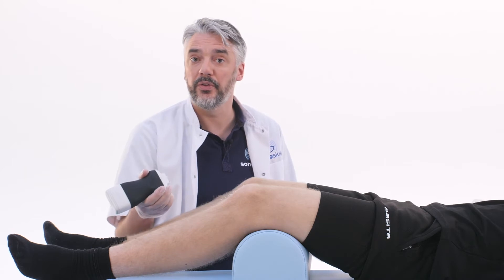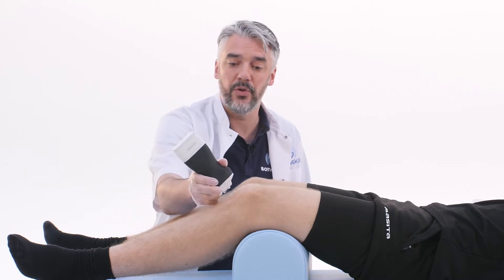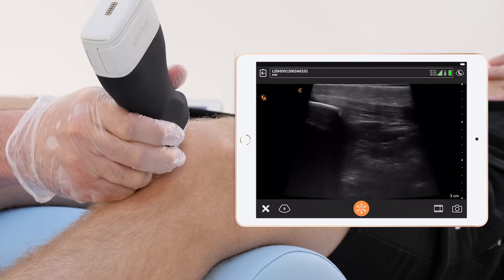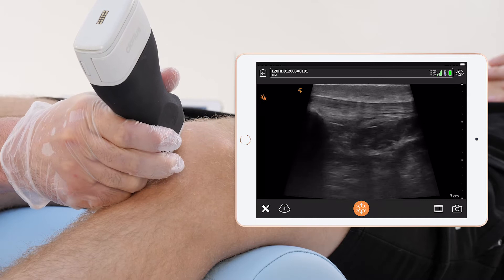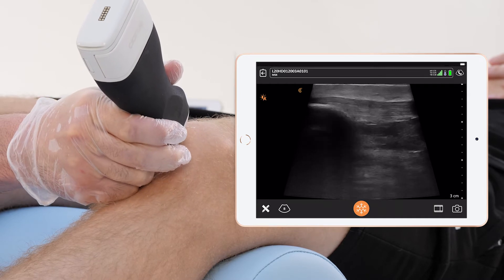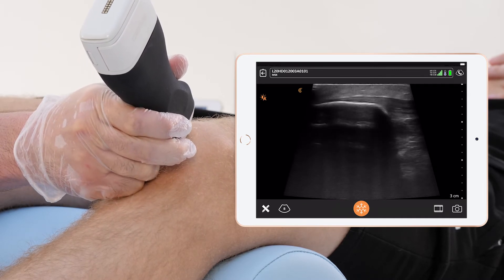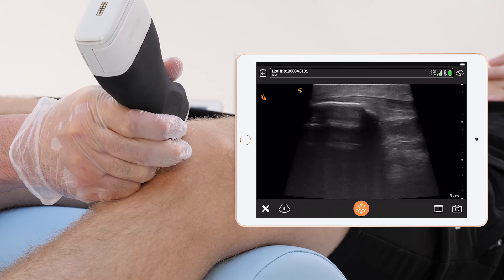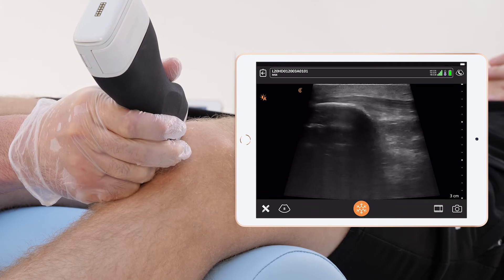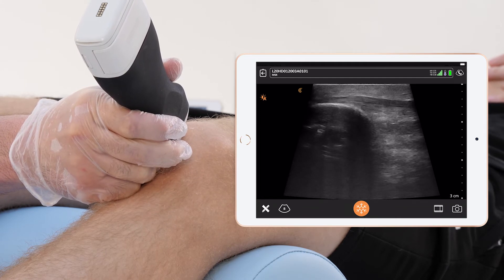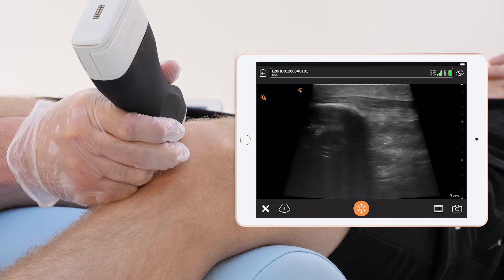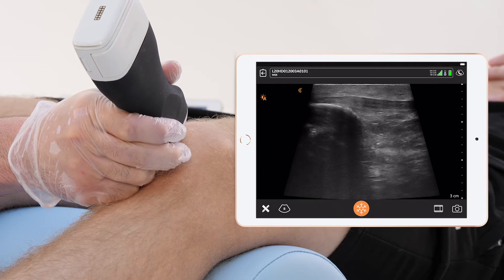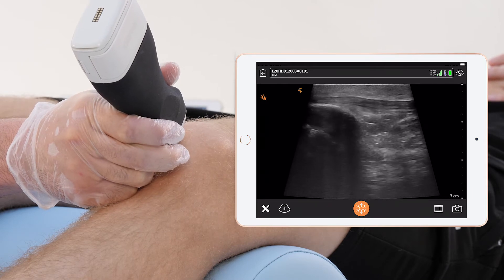First we will scan the long axis view, placing the transducer on the patellar bone so we can assess the origin of the patellar ligament. Make sure to pay attention here, because this is a very famous spot.